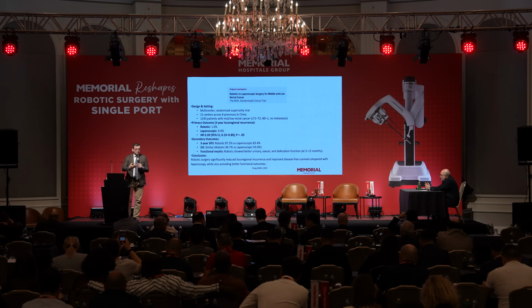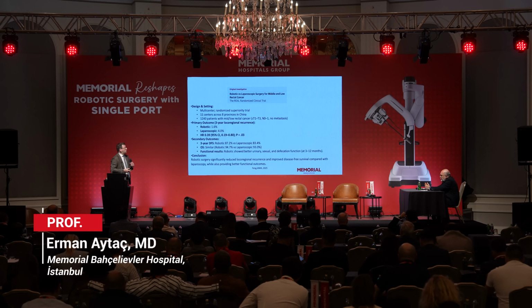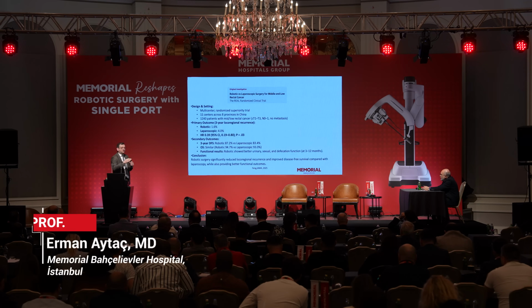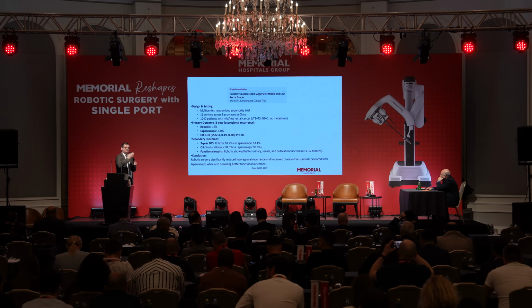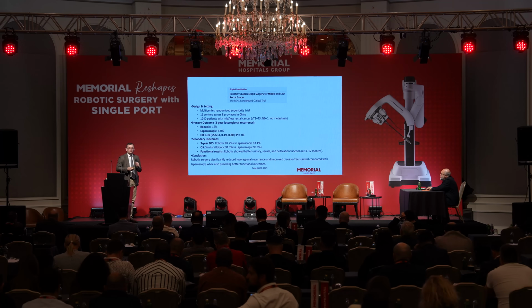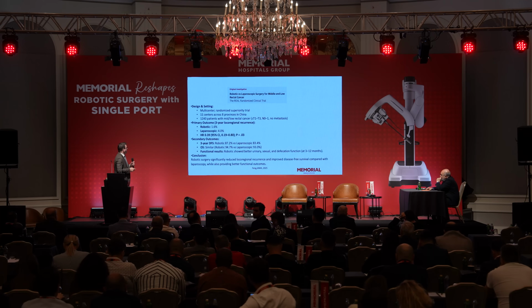why are we doing this, if we are not achieving better oncological outcomes, and we are not achieving short-term recovery benefits compared to multi-port? It is the learning period for everyone. We have been applying robotic surgery for the last 15 years, and we only now have randomized level evidence for the superiority of the robotic platform in the field of rectal cancer surgery. This paper from China is a turning point paper.